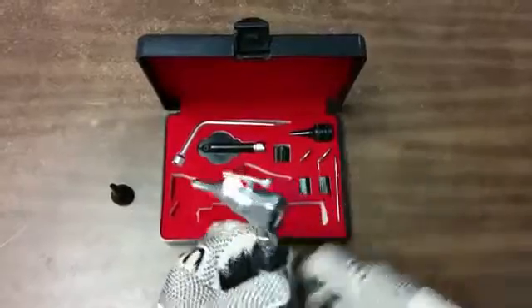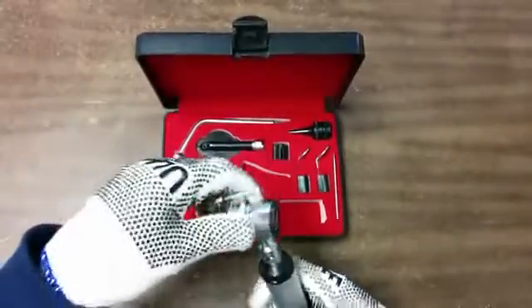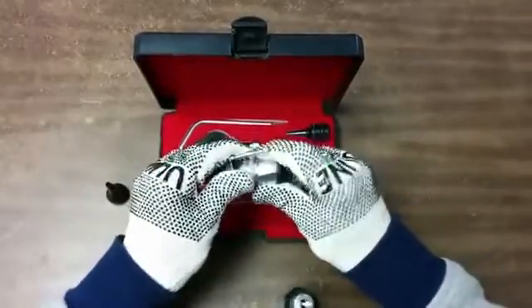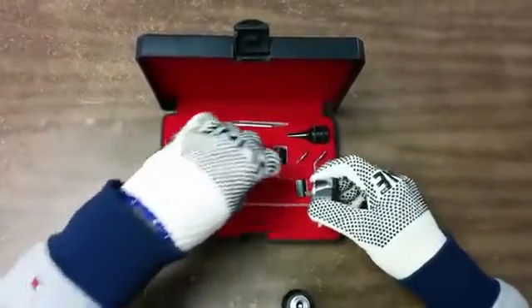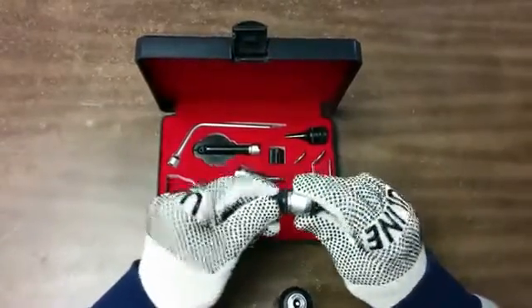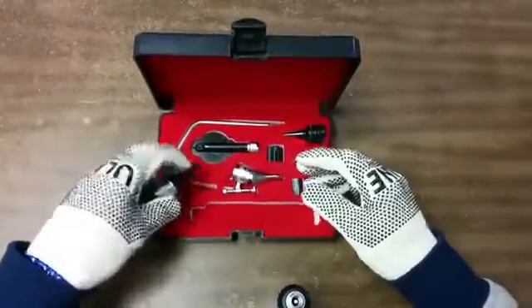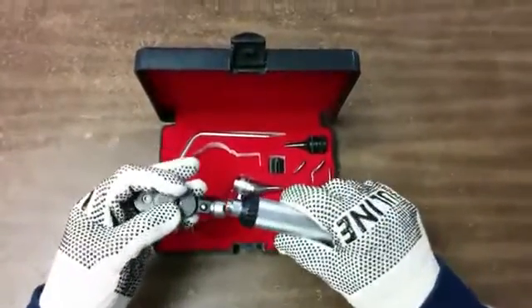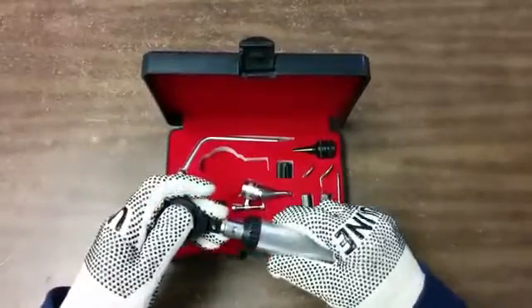Turn it off again, take this off, and remove this part. Bring it back, then this one here. Grab this part the same way — align and turn.